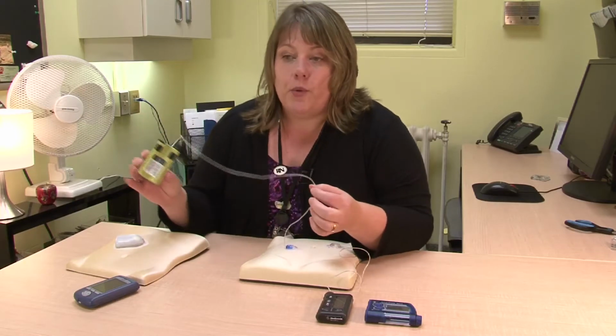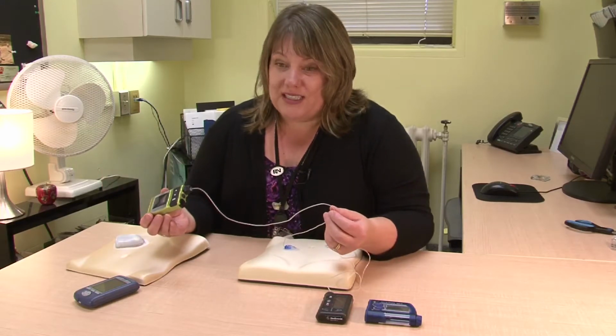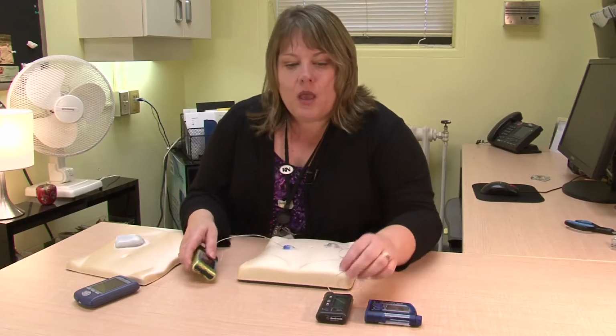But it would be attached. Important to know there are longer tubings. This is probably the average length of tubing, but there are some that are even longer, because sometimes I've had patients that will wear it in their boot. So it's got a longer tubing, runs down their leg, and it's in their boot, but it should be attached.